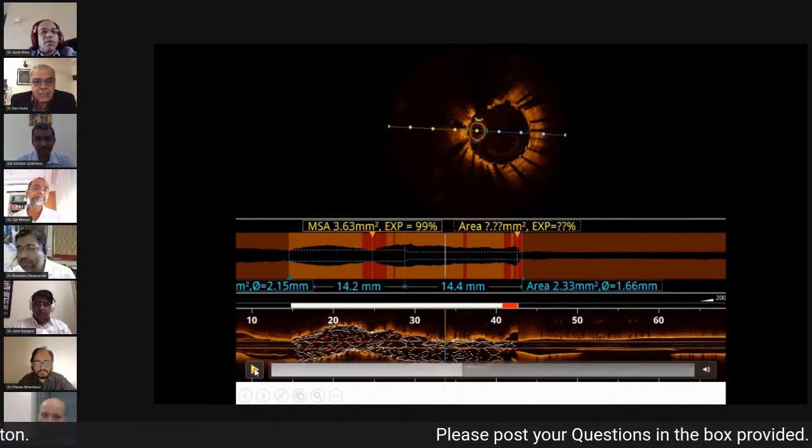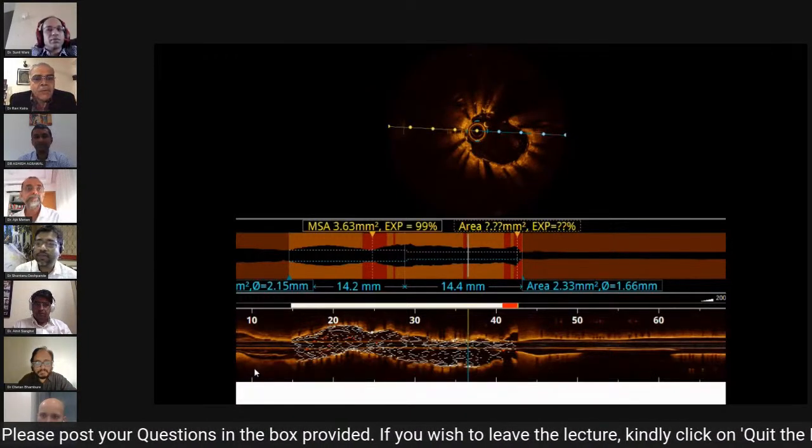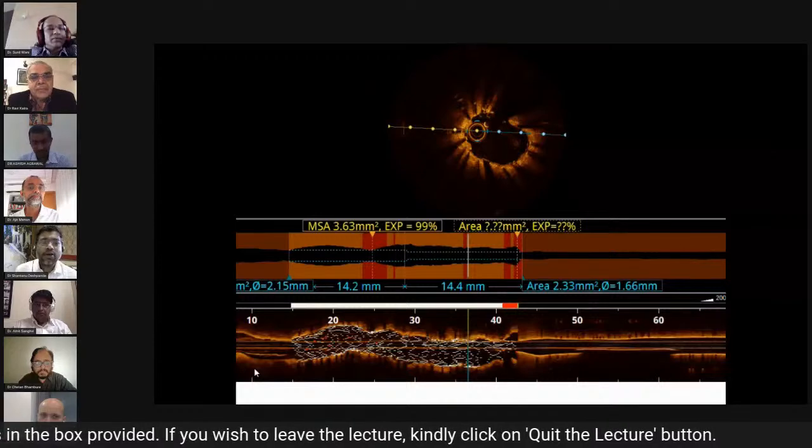There is one more question. Can we use Rota in a 6-month-old stent? Yes, you can. Definitely, you can. We have already discussed that. Okay, go ahead, Ashish.